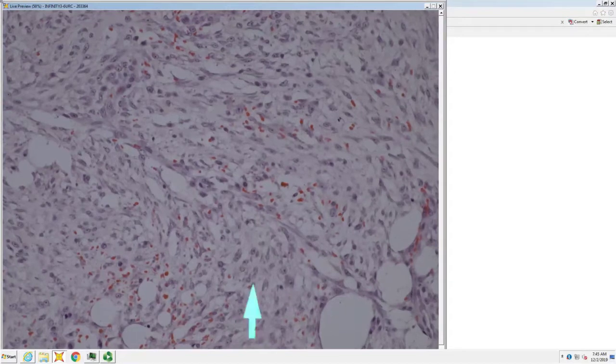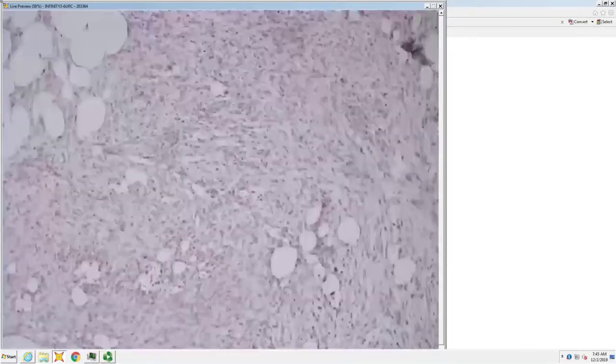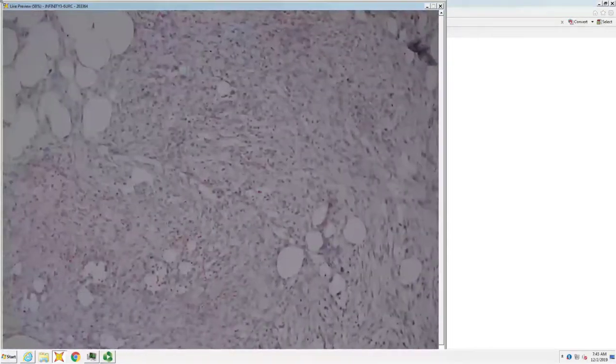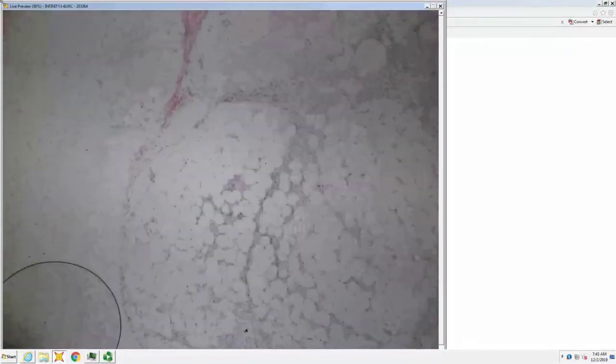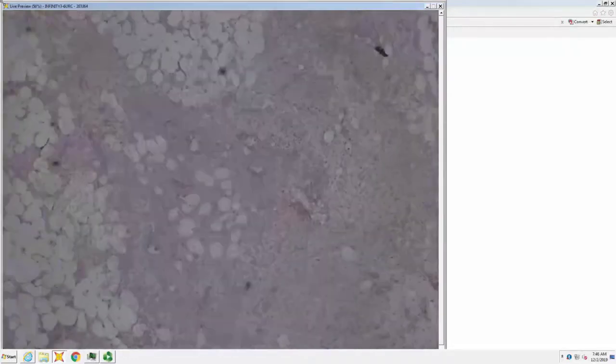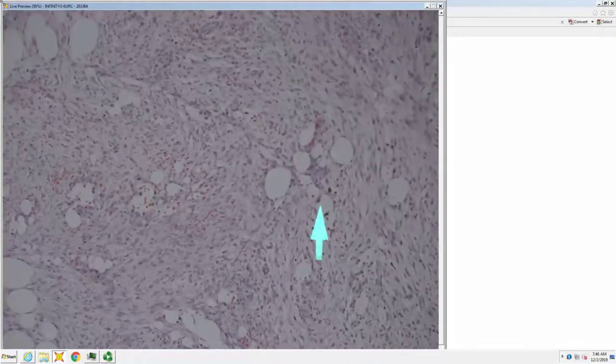Here I see lots of microvesiculation in the stroma. So the stroma has lots of microvesiculation, red cell extravasation, tissue culture like fibroblasts in a deep process, like nodular fasciitis. But what kind of variant of nod fash grows into the septi and fat in a pattern similar to DFSP and has ganglion-like cells? That's proliferative fash.